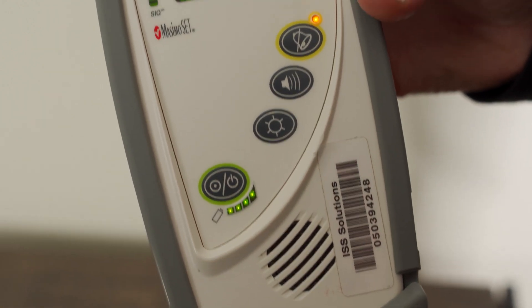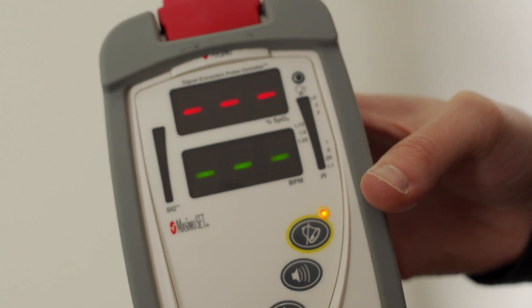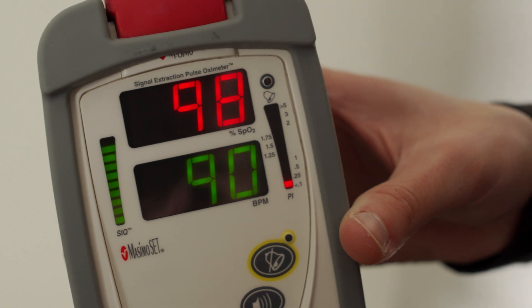You turn the power on by pushing this button here at the bottom. After a few moments, the numbers will appear. The number on the top is the percent SpO2, and the number on the bottom is the heart rate.